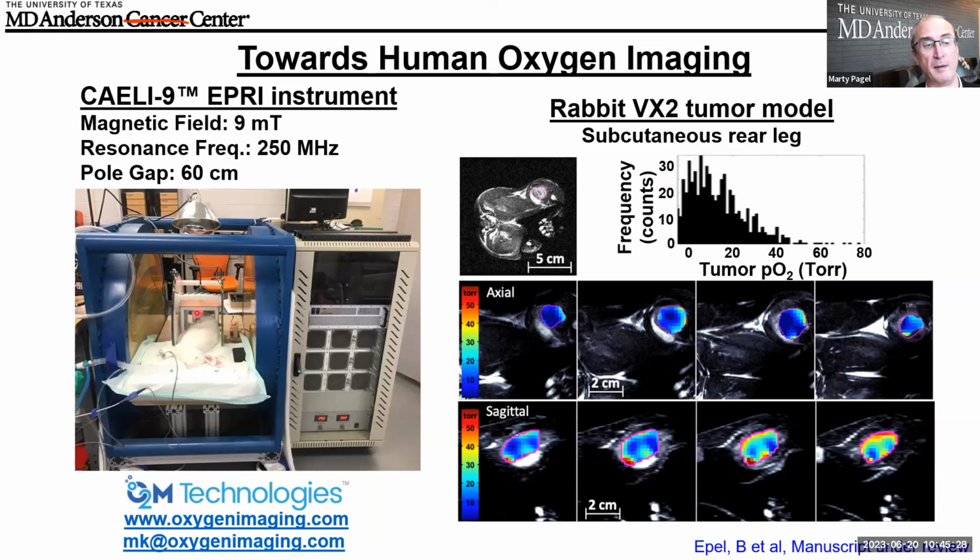Of course, more development needs to be done with the resonators and pulse sequences and energy deposition and contrast agent approval and so on. But you could say the same thing 25 years ago about a lot of our MRI technologies or PET technologies, where others brought up that there were impediments to those technologies, and look where we are today with those other techniques. So I'm excited that someday EPR imaging will also be in our clinical radiology clinics based upon these initial steps.